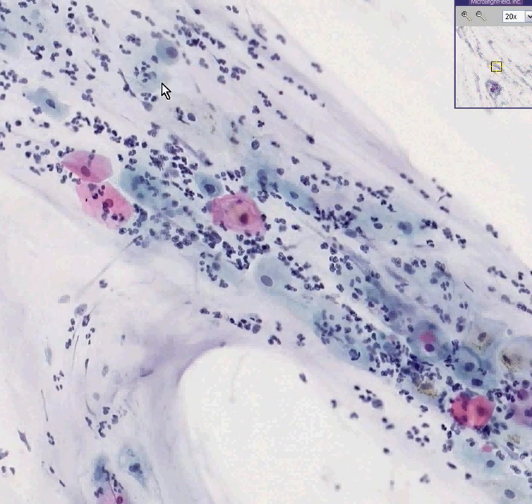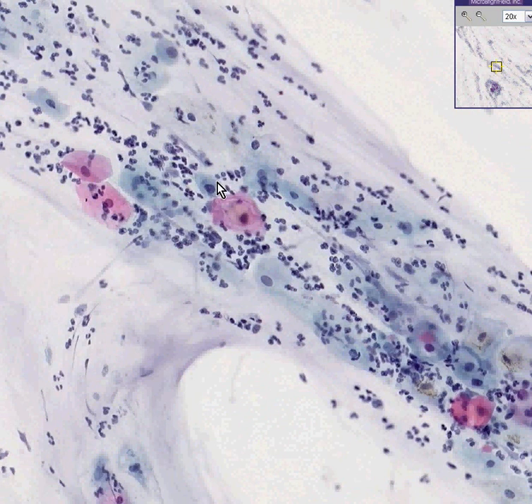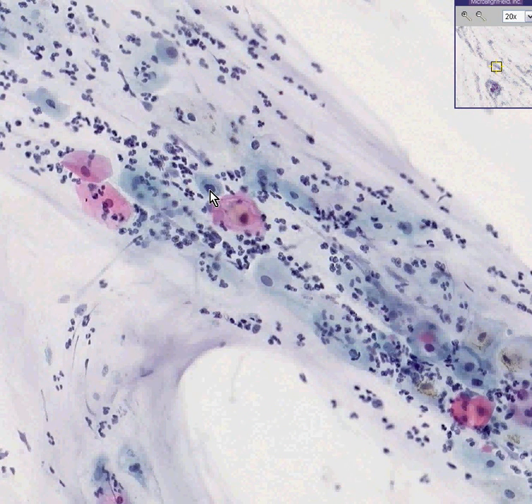Notice most of these cells are inflammatory cells, but you can see epithelial cells here, here, here, here, here, here, here, here, here, here. Notice that some of these epithelial cells have nuclei which are a little bit bigger and darker than they should be.